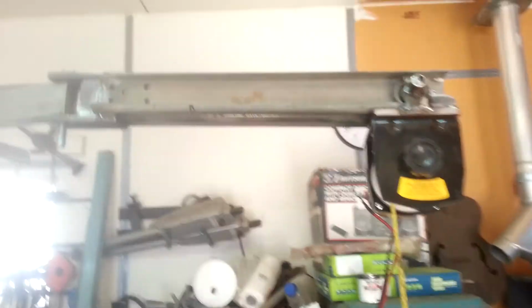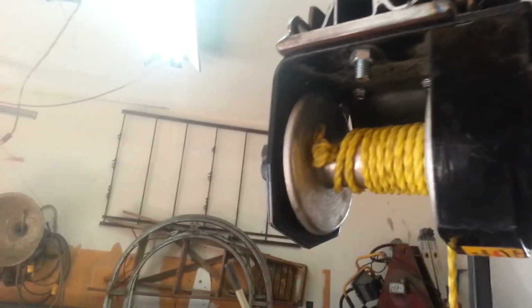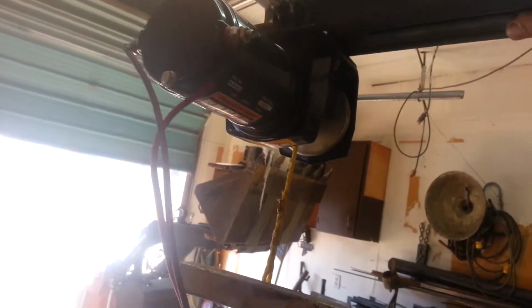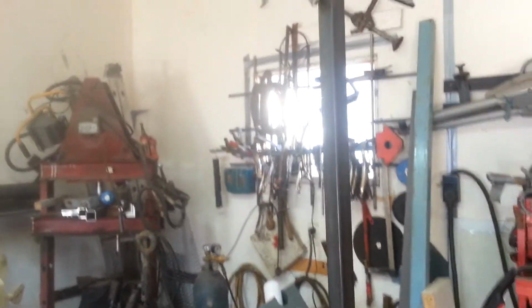So now anyways, you've got your wheelchair lifted up, nice controls, easy to use. You bring it back into the van. It's hard to do this with one hand. In the van it goes, taking the weight off it.